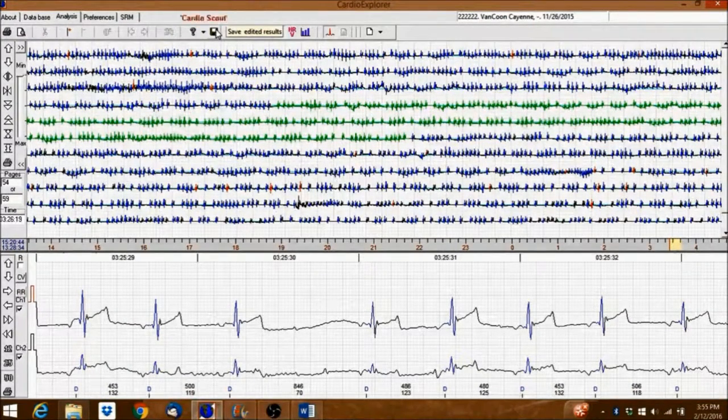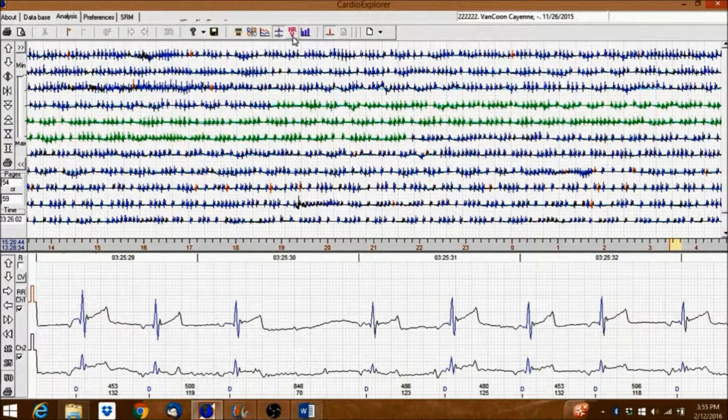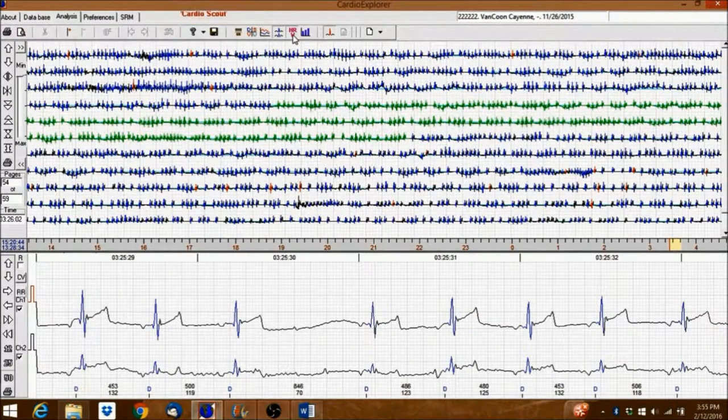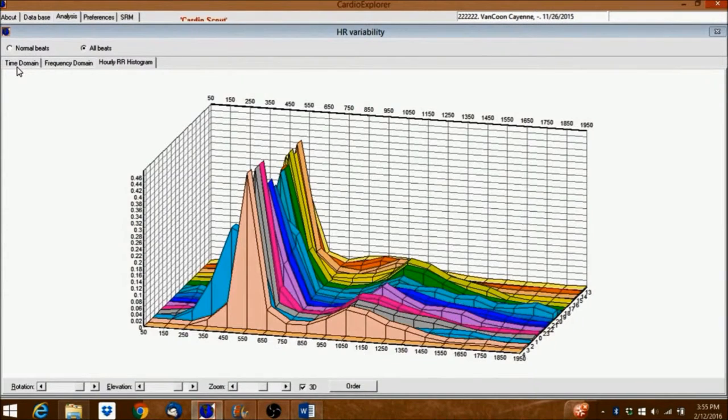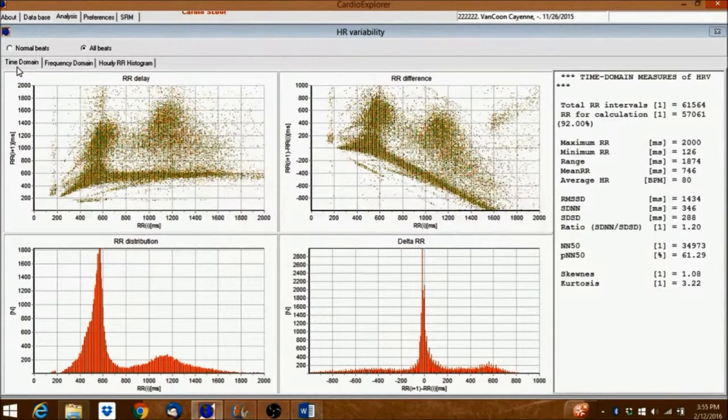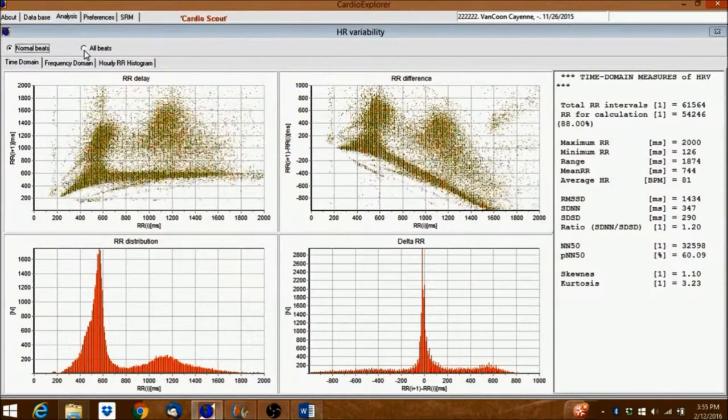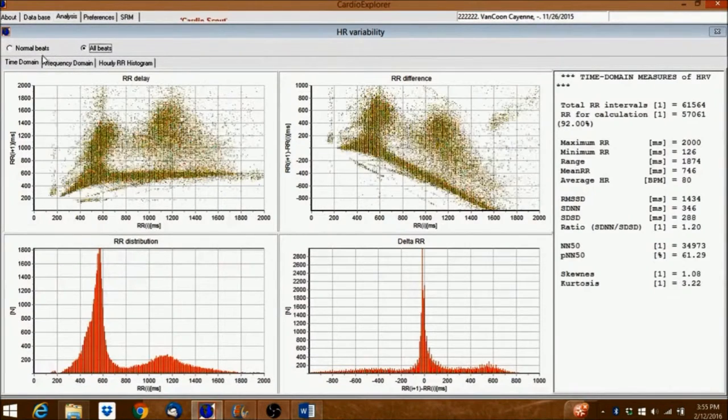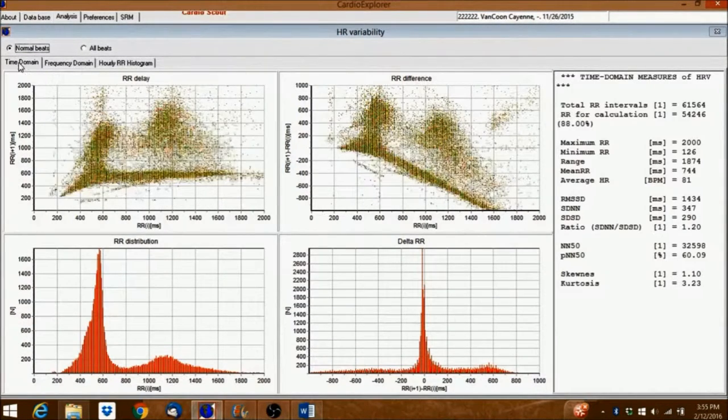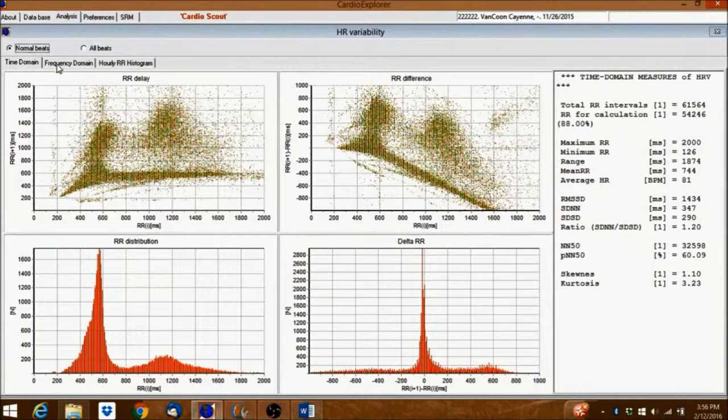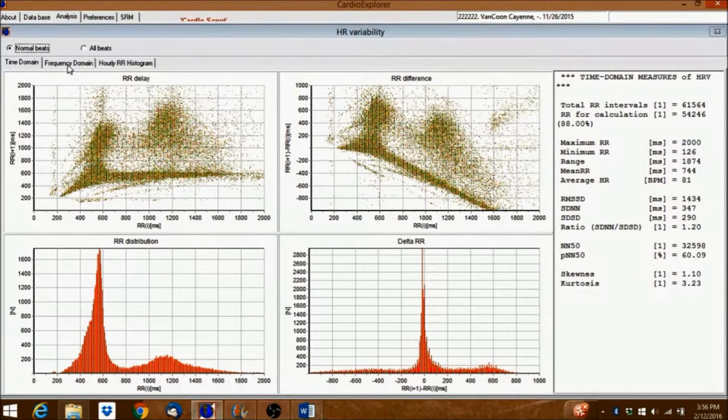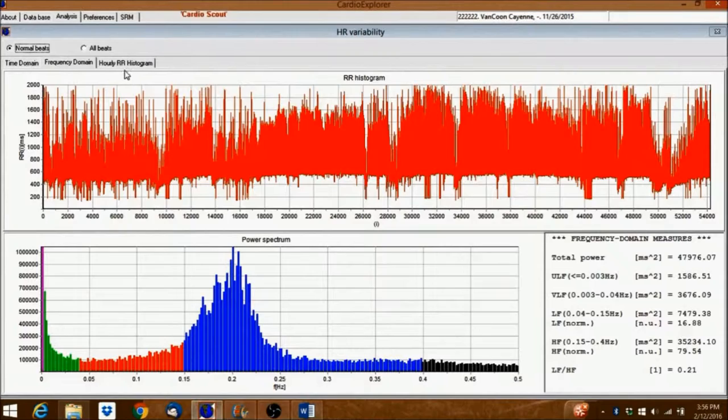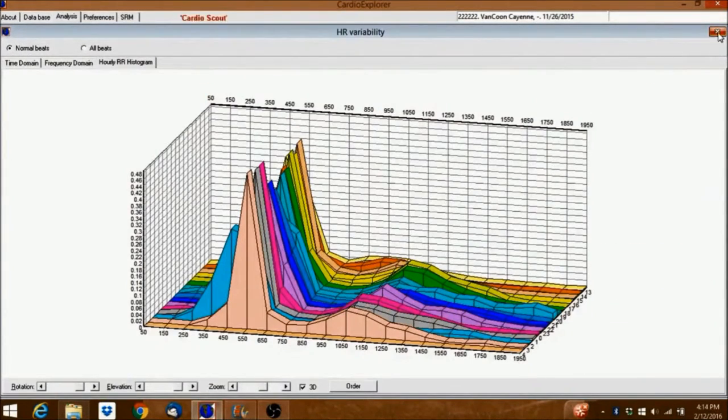Before we create a report, click on the HRV icon to switch to the heart rate variability window. Here you can choose to display the normal beats or all of the beats. You can also choose to display the time and frequency domain as well as the hourly RR histogram. Go back to the previous window now.